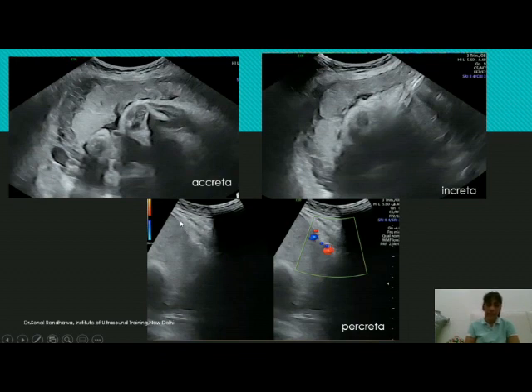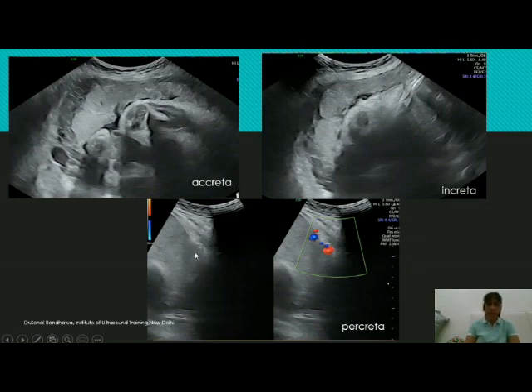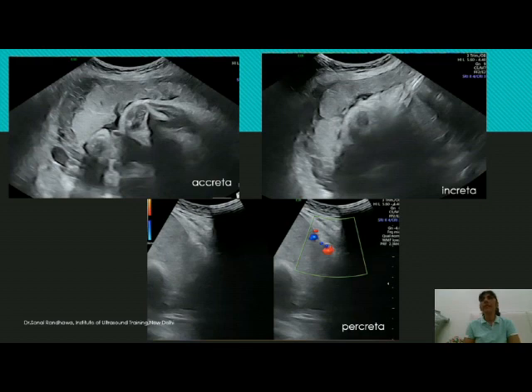In the third area of the same patient you can see the serosa very clearly up to a certain point, and then in another area not only has the serosal layer become irregular, but it has also become hazy — you cannot clearly make out where the serosal layer is. It seems to be invading the serosal layer. So we can say clearly that this is percreta.